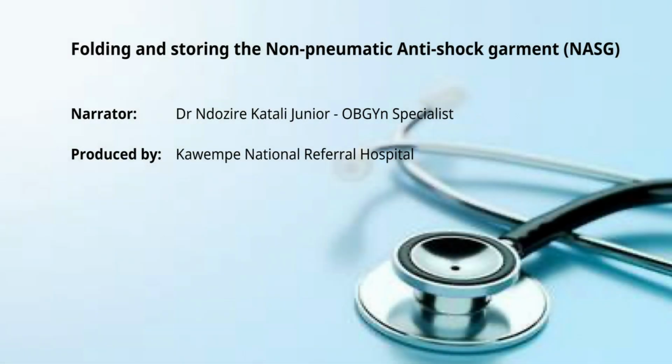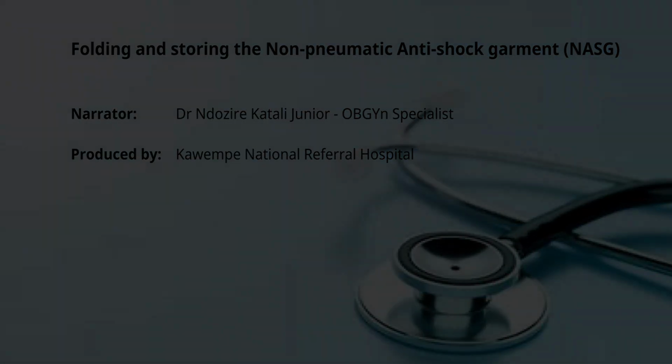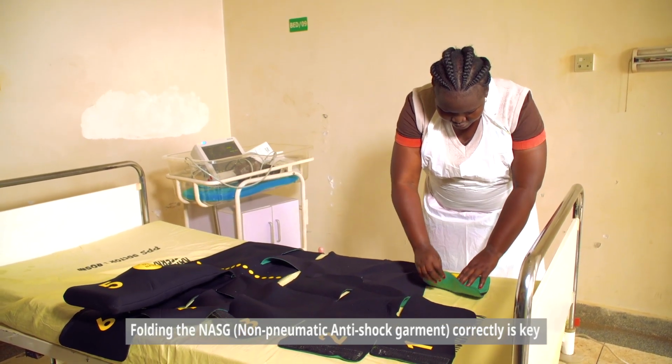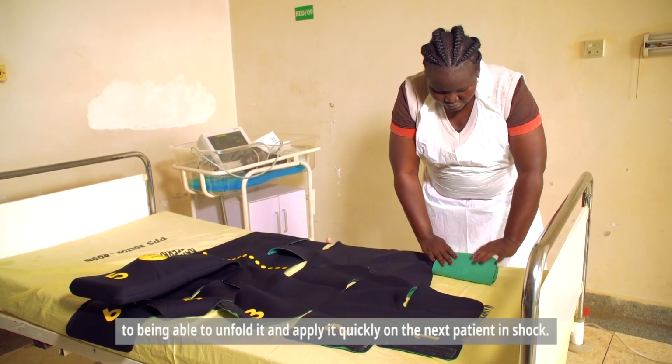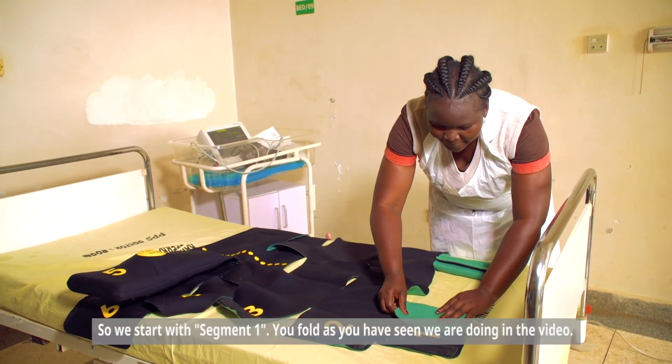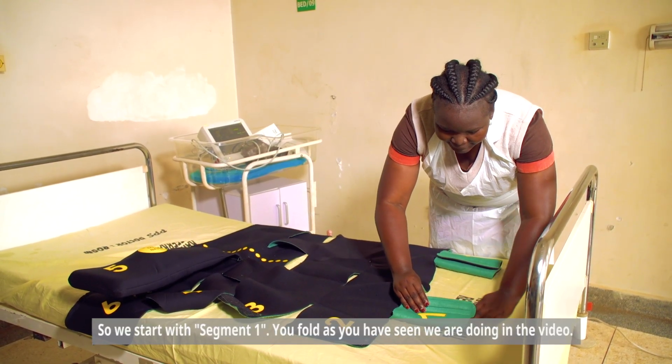The next step is folding and storing the NASG. Folding the NASG correctly is key to being able to unfold it and apply it quickly on the next patient in shock. So we start with segment 1.